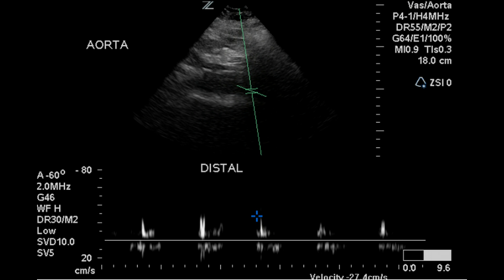The distal aorta was also interrogated with Pulse Doppler, and a monophasic turbulent signal was obtained. There is no evidence of reverse flow in this portion of the aorta, which is highly abnormal.